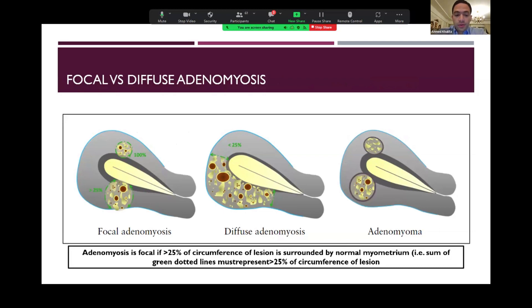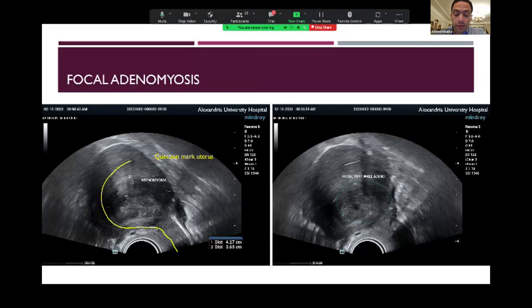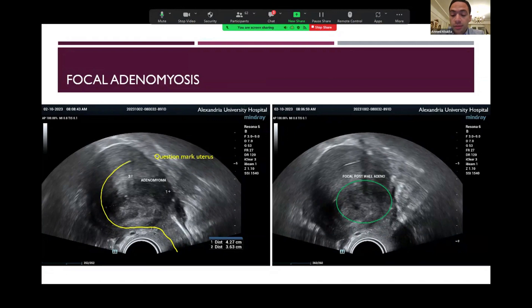There is a difference between focal and diffuse adenomyosis. Focal adenomyosis, by definition, means that the lesion — about 25% of its circumference — is surrounded by normal myometrium. As we can see in this diagram, the circumference of the lesion is mostly entirely surrounded by normal myometrium, so this is, by definition, focal adenomyosis. As we can see in this sonographic picture of focal adenomyosis, most of the circumference of the lesion is surrounded by normal myometrium. There is also a very important sign called the question mark uterus or question mark endometrial cavity, which is a sign of uterine adenomyosis.